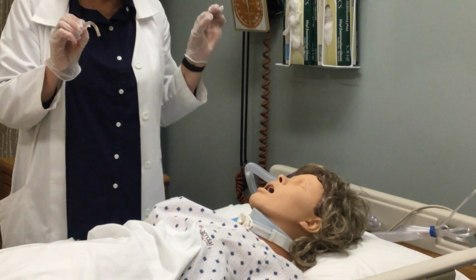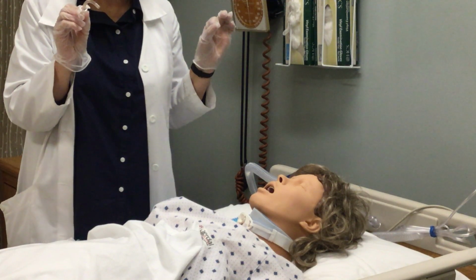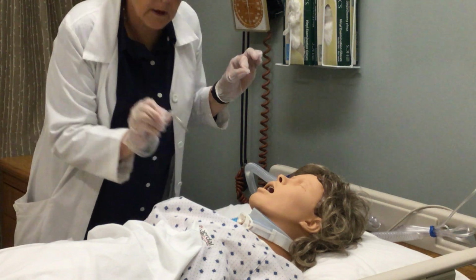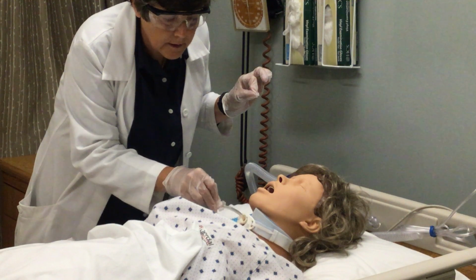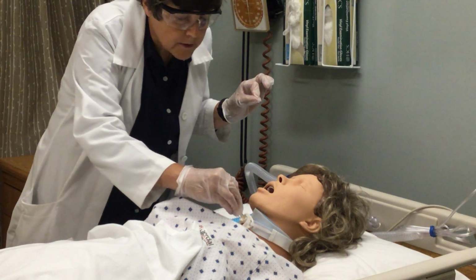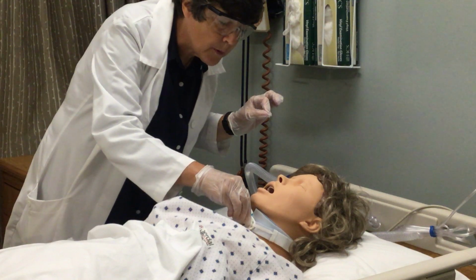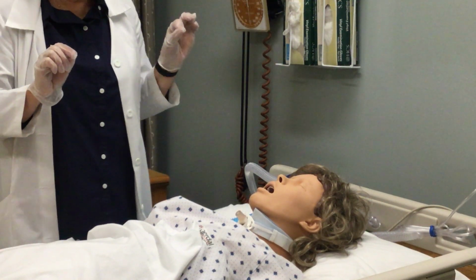Place the new inner cannula and lock it into position. If necessary, reconnect the patient to the ventilator or other oxygen source. Okay, so I start mine sideways. And as I insert it, I twist it around and it should slide in pretty easily. And then I pinch it into place and I make sure it's secure.